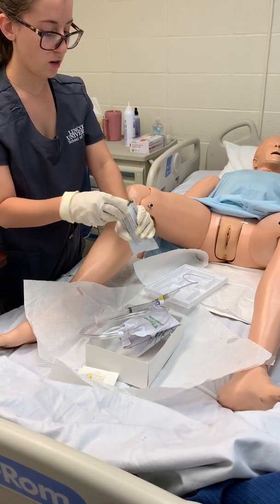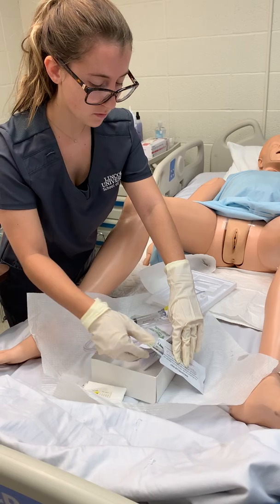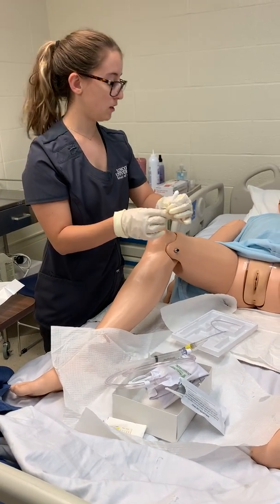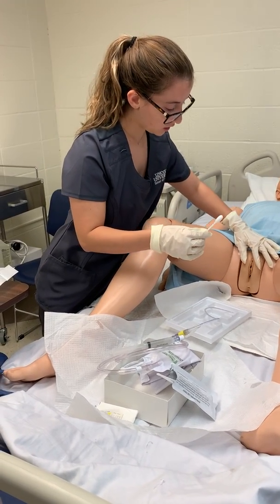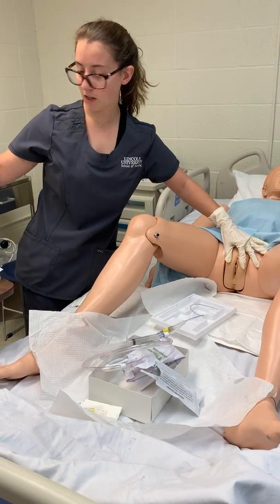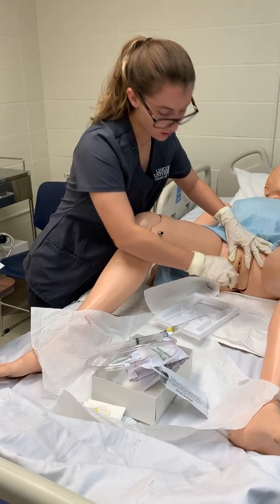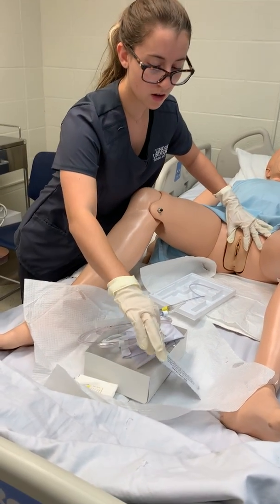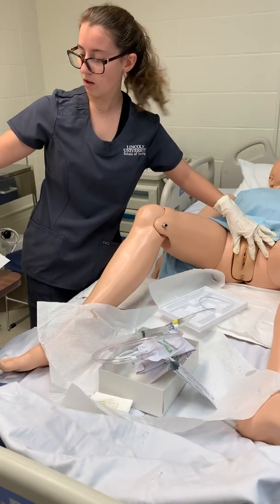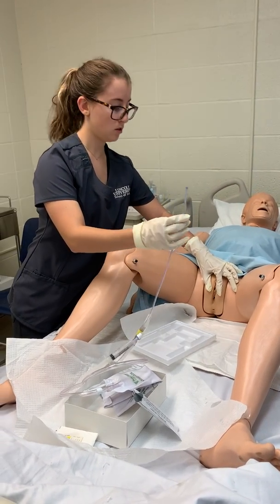Alright, and now I'm going to go ahead and start with my swab sticks. My left hand is my non-dominant hand, so it's going to become unsterile while I do so. So Miss James, I'm going to go ahead and touch you and just spread your folds. Clean one side and discard. Go to the next side. Clean it and discard. And I'm going to go right down the middle with the last one. And discard of that.